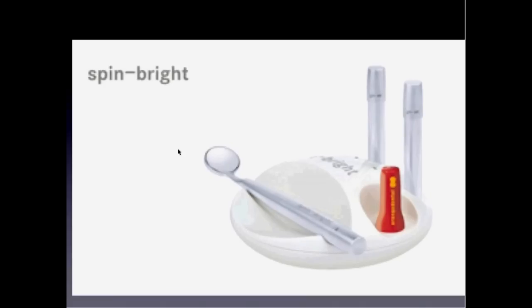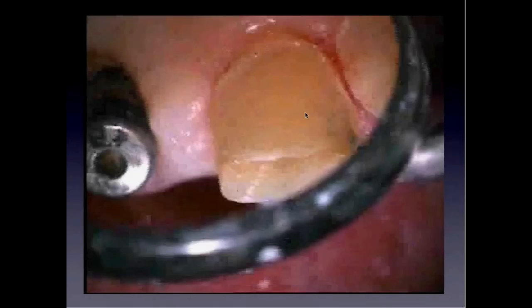When I work in the upper jaw, I like to use this spin bright mirror, which has a rotating mirror surface. It rotates at about 1500 rounds per minute, and so it spins the water and the debris away, and you have a clear sight of the area you're working on all the time. And the more you work on the palatal or oral side of the mouth, the more important the microscope is, because, as I said, you can sit straight, work straight, and look straight ahead.